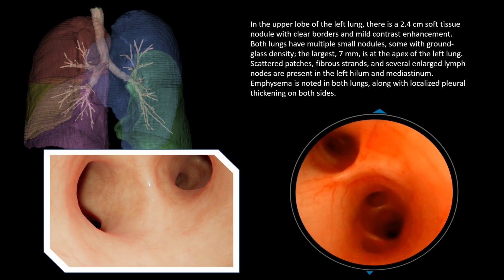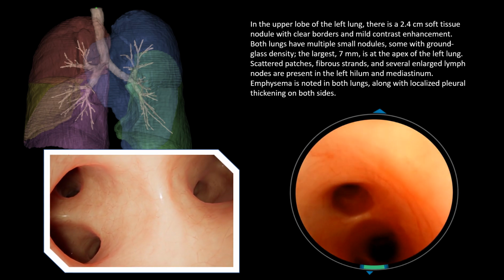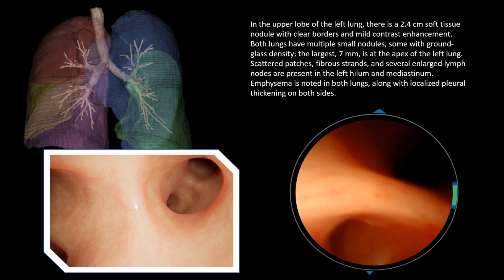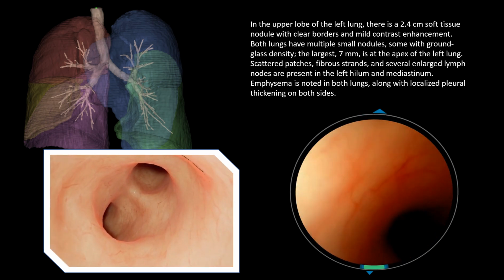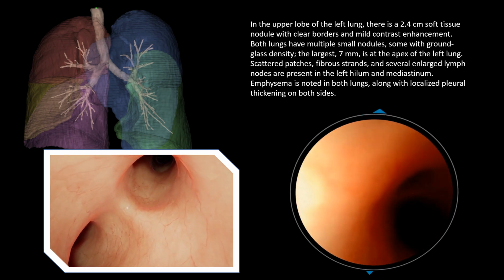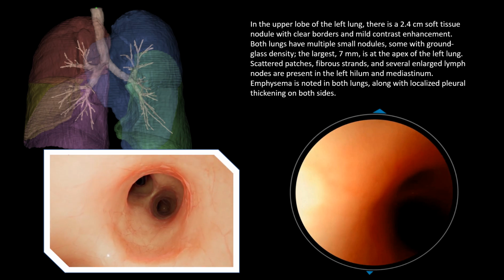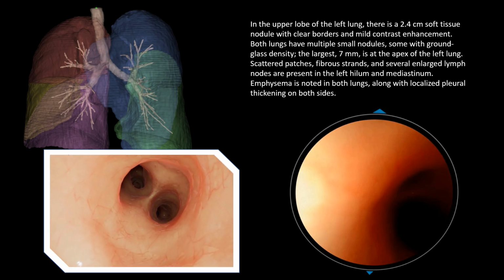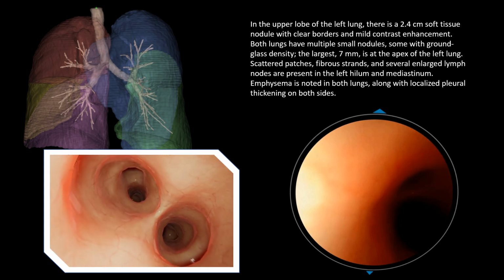During bronchoscopy, navigation through the complex bronchial tree is essential, especially when targeting small lesions. Robotic-assisted navigation offers enhanced precision and stability, enabling clinicians to reach specific lung regions more accurately. As a result, these navigation technologies play a critical role in improving diagnostic and therapeutic outcomes, making them an indispensable part of modern pulmonary interventional procedures.